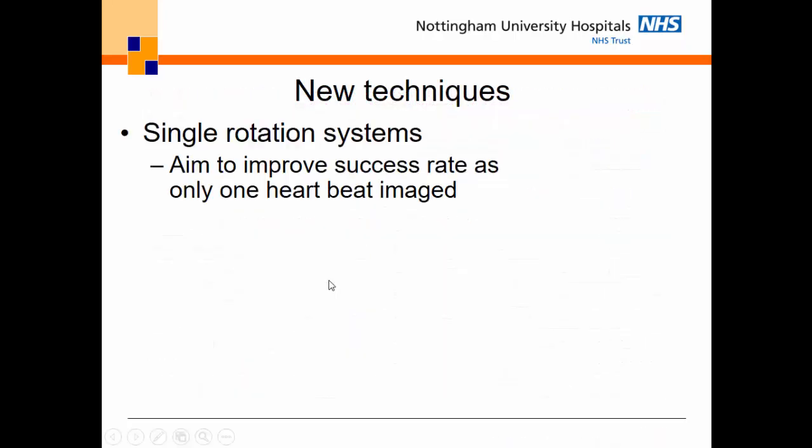Okay, some of the new techniques that are coming along. So there are single rotation systems. There are certainly 3 on the market now, I think. In terms of single rotation systems, the idea is that you can scan the entire heart in one heartbeat. So as long as you get that one beat correct, that's it, you're finished. It doesn't matter whether they've got a regular heartbeat after that.